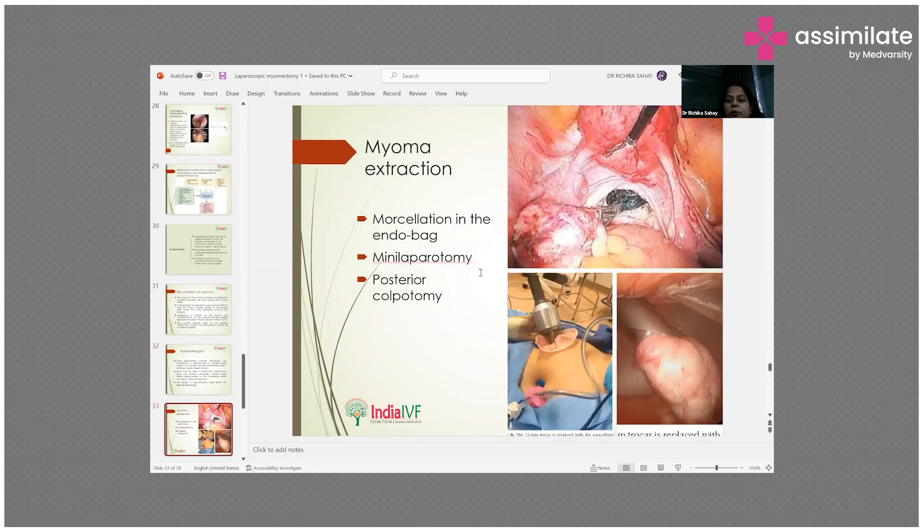For myoma extraction, the specimen is placed in an endobag and morcellated inside. A mini-laparotomy can also be performed to remove the morcellated specimen, using a small incision — smaller than a full laparotomy — through which the endobag is extracted after morcellation.